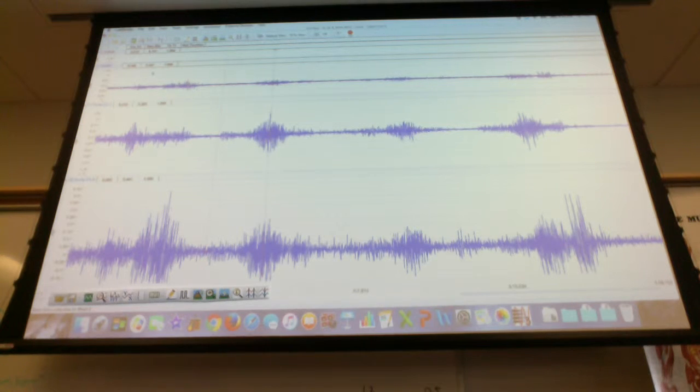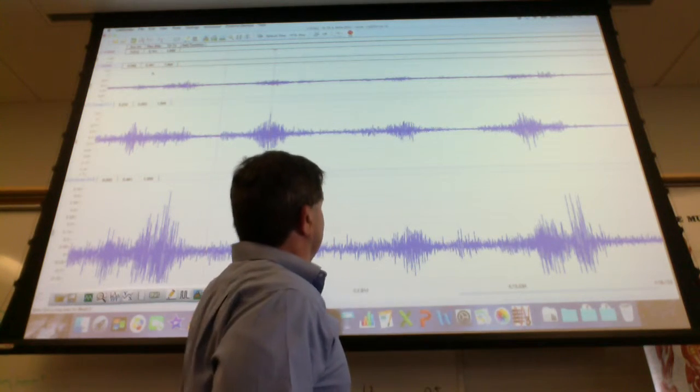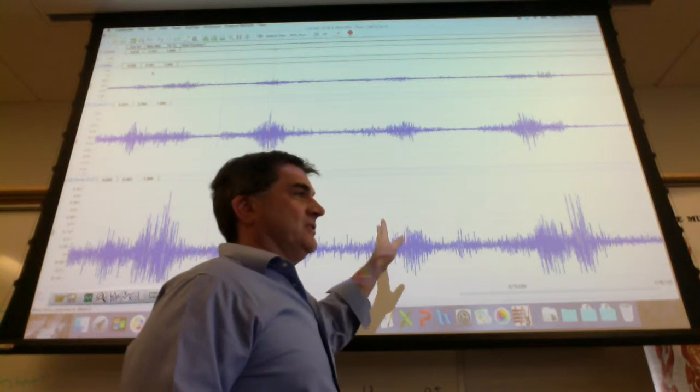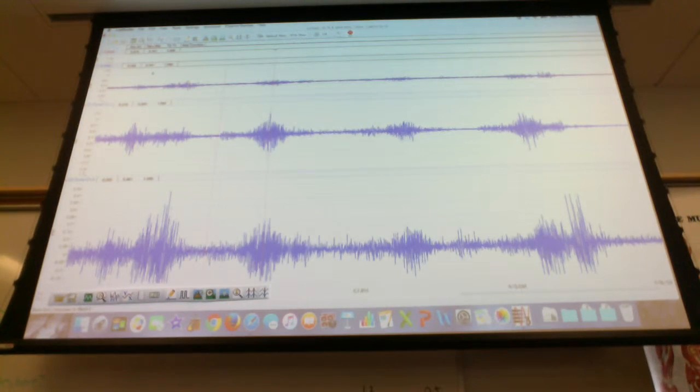So the next one you're going to do, you're just going to move on to your next flexion. Do the same thing, right? So again, I just put my arrows at the flexion, and I measure before and after. And I do that for the second flexion. And again, I record data for the anterior and posterior, and then I do the same thing for the third flexion. So just go through and do that with the other two. Try to find your flexion.